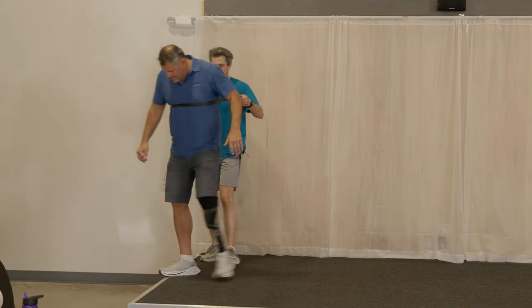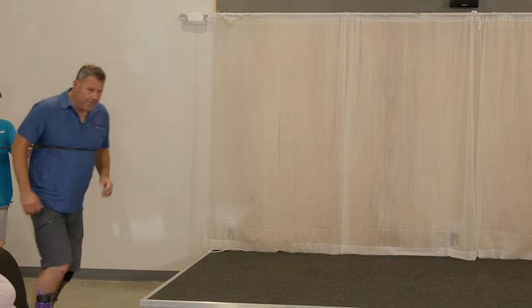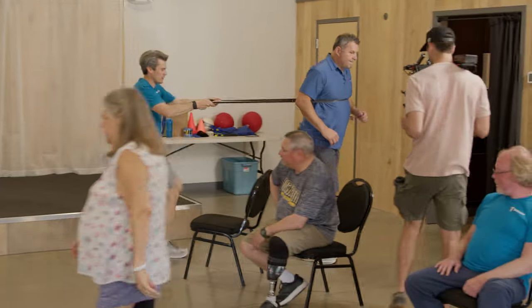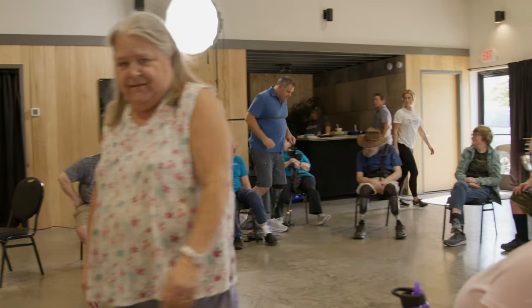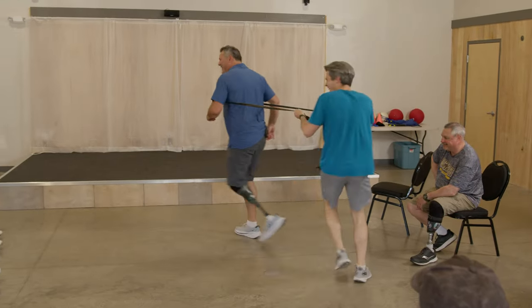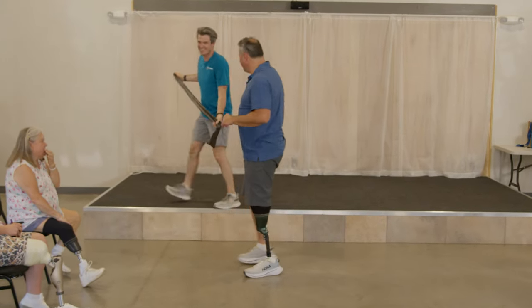Show that position again, Scott. So it's almost like you've caught yourself with the wall. See how Scott's standing on his toes — he's keeping his knee bent a little bit. It's like water skiing.